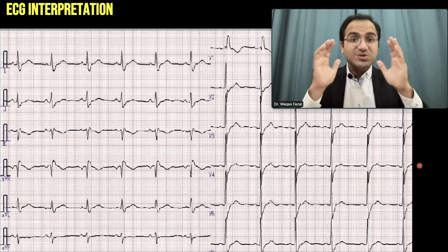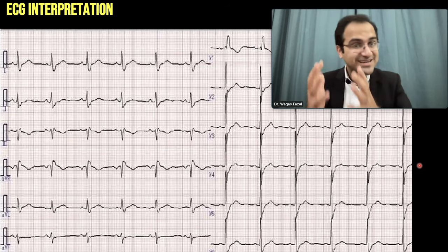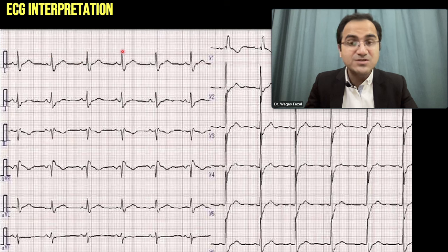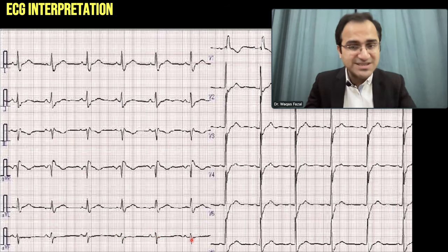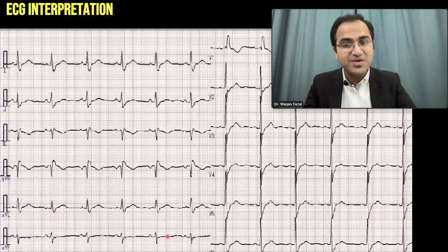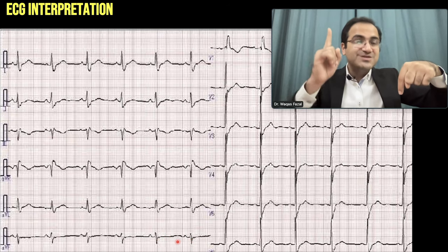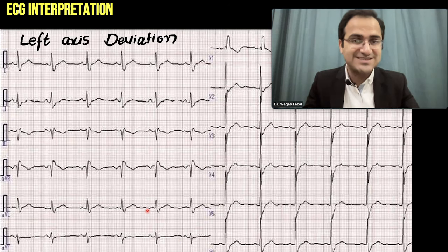Pause the video and solve this ECG — find whether it is normal, right axis, or left axis deviation. Coming to the answer: Lead I is predominantly positively deflected — pointing upward. Lead aVF is predominantly deflecting downward; although there is some upward deflection, the predominant part is downward. So Lead aVF is pointing downward and Lead I is pointing upward — they are leaving each other. 'Left Leaves' — this is left axis deviation.